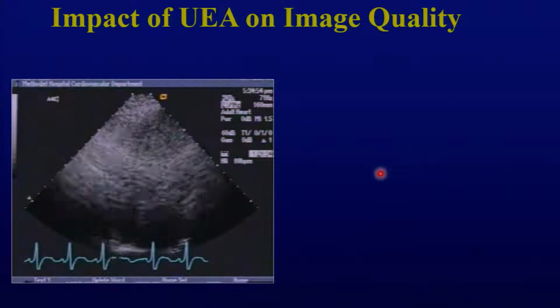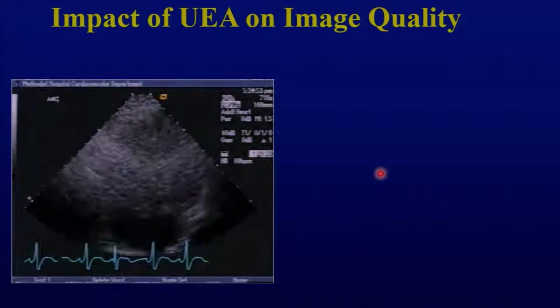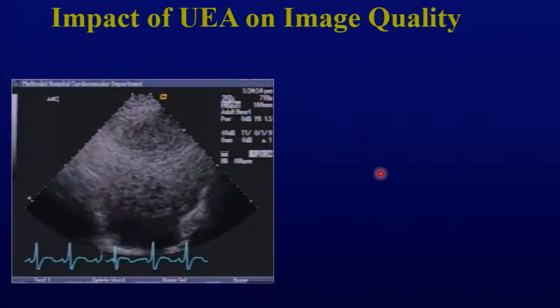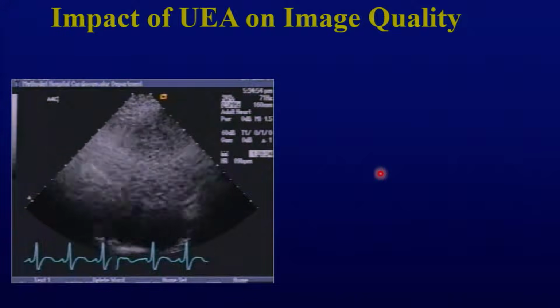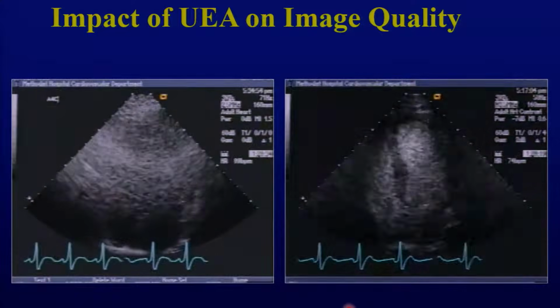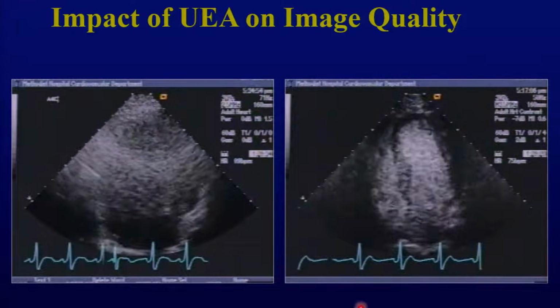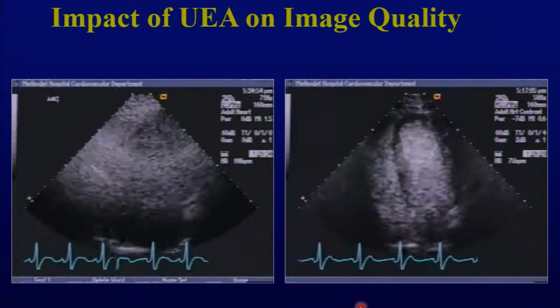Usually we do not show images so bad, but I think this is where contrast is important, right? You tell me how much you can interpret from this heart. You could see some silhouettes, maybe the left atrium, etc., but you can't see much. And the beauty of these contrast enhancing agents is they really enhance the situation. You could see the heart now, you can quantitate, evaluate regional function, etc. Truly very impactful, no question about it. And you could do it in the same setting.